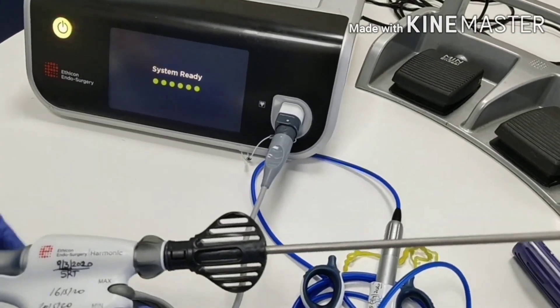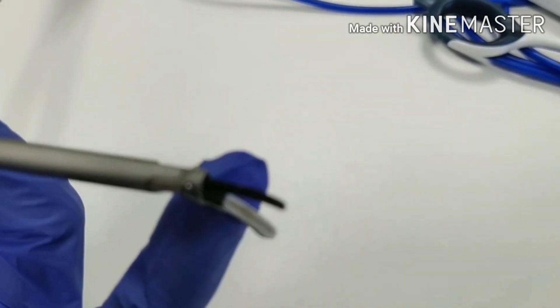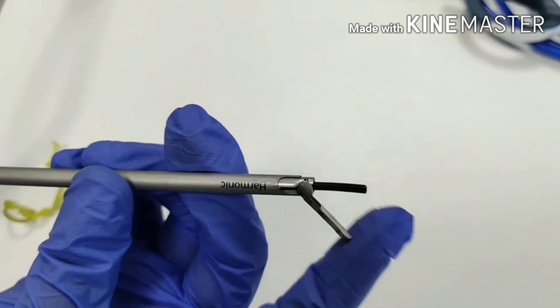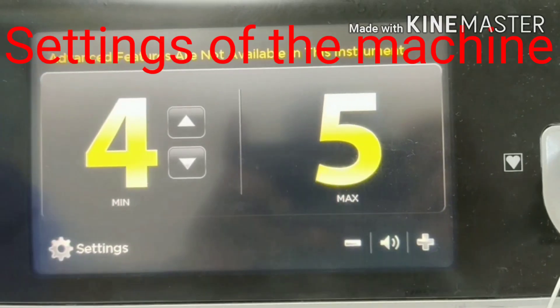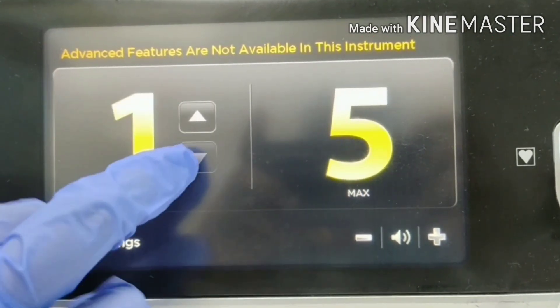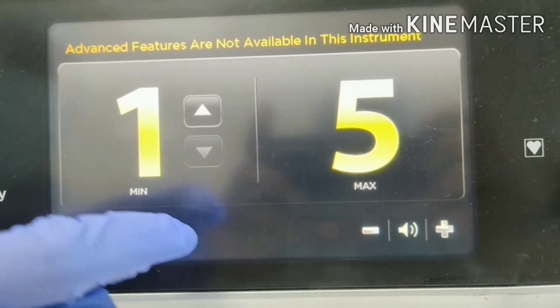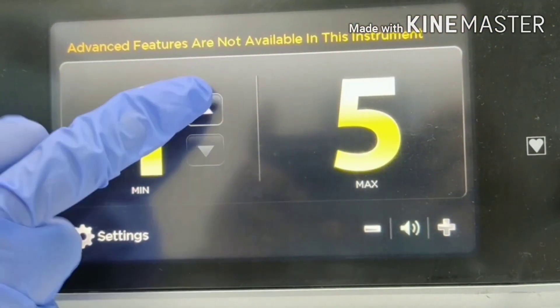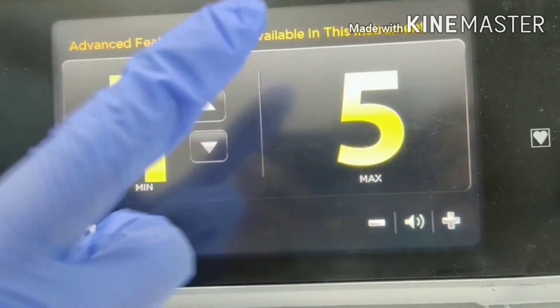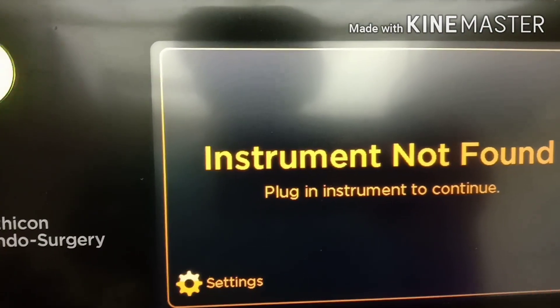This is the active blade — energy will be passed through this blade; this other side is totally inactive. We will see the settings of the machine on the display. We can only adjust the minimum setting from one to five as per the doctor's requirement. Maximum is fixed and cannot be adjusted. Now we will see how to select hand activation or foot activation.